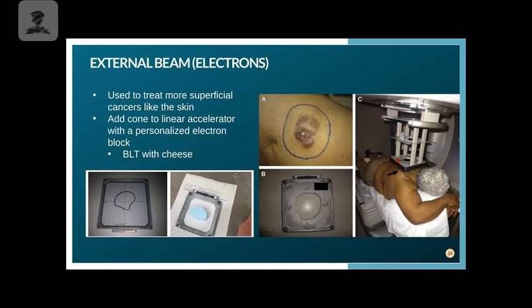And so the outside of the pot is going to have a little spigot, just like it would if you were getting a lemonade out of a little lemonade stand, like the jars where you pull the little spigot and it pours out the lemonade, just like that. But you're going to have a cup that you'll put underneath this pot of liquid metal, and you're going to open the spigot, pour it into the cup, and then pour it around the shape of that styrofoam. And you're going to fill it up until it reaches the top of that mold. So it would reach the entire outside here.